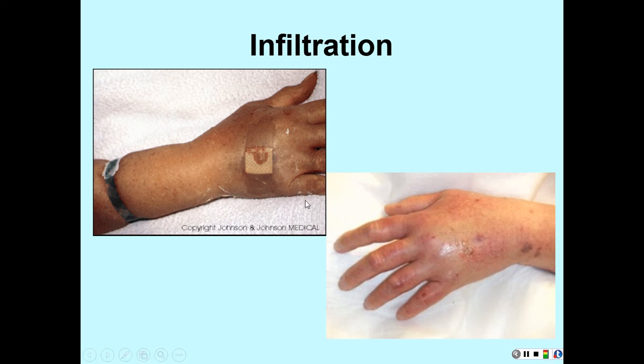Now keep in mind, some of your patients, this lady right here, if they're elderly and you elevate, let's say they're laying in the bed and you elevate their arm up on a pillow on them or on a pillow beside them, where's that fluid going to go? It goes right here. Okay? So then they have this big, huge elbow.